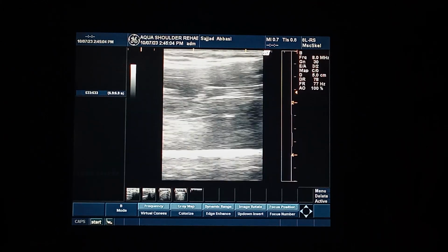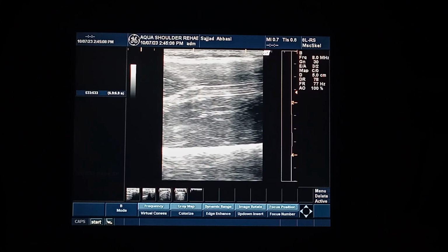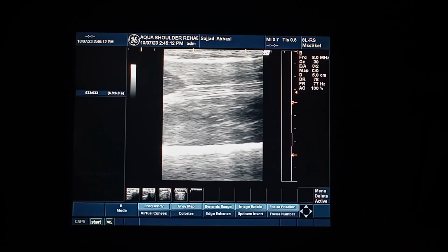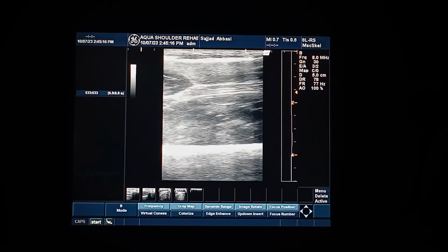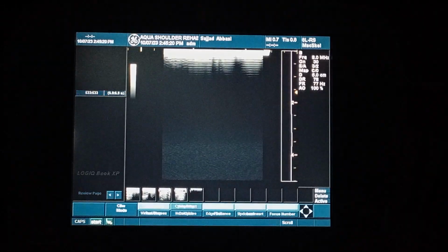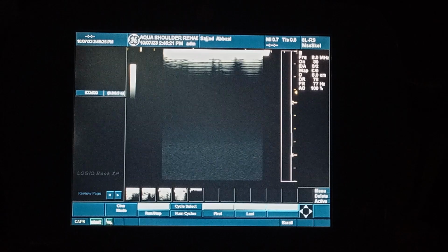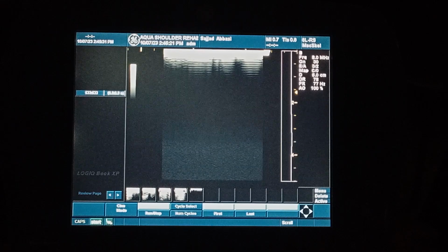And let's try to elongate it. Now the nerve is elongated, and now you can see these parallel lines. Can you see? Yes. And with my flexion and extension of the wrist, I can clearly feel the movement of the nerve. Because I'm doing it on myself, it's a bit difficult to stabilize the transducer, but let me show you the tricks that you can use, or what are the movements of the transducer in more light.